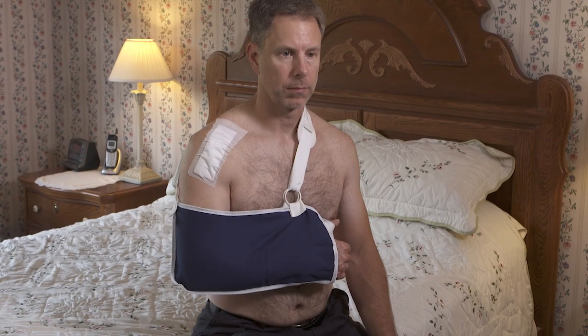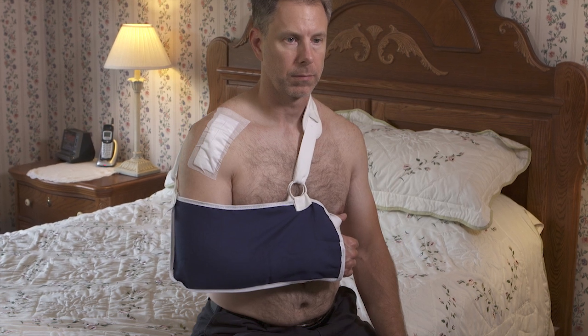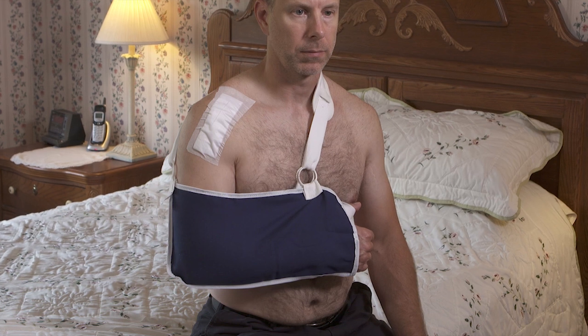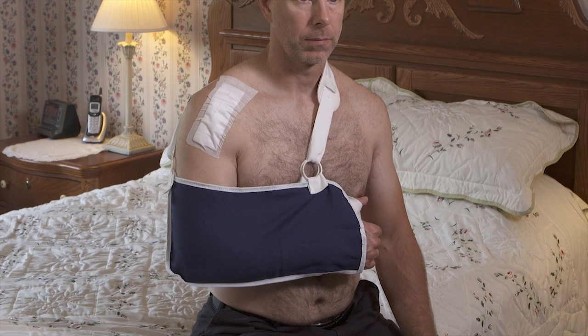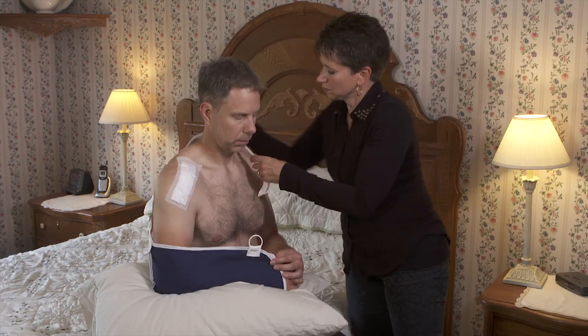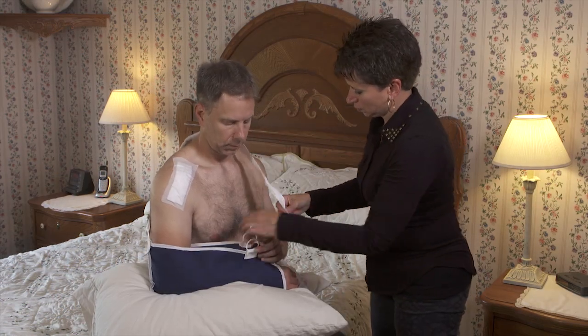When taking a shower, you may be told to wear a shower sling as your shoulder heals. It supports your arm and makes sure you don't reach out. Do not shower until your surgeon says it is all right to do so. Most people need help putting the sling on and taking it off.